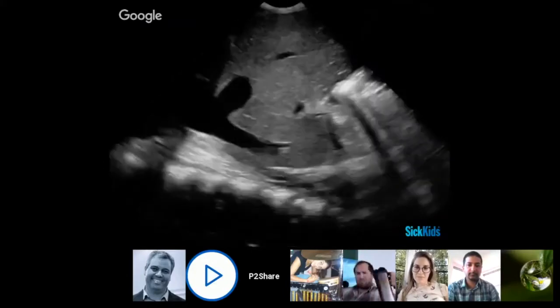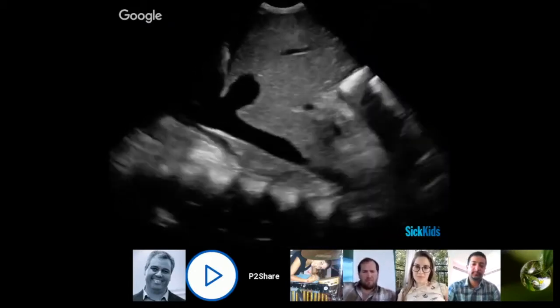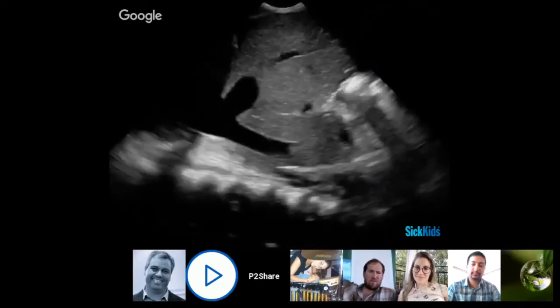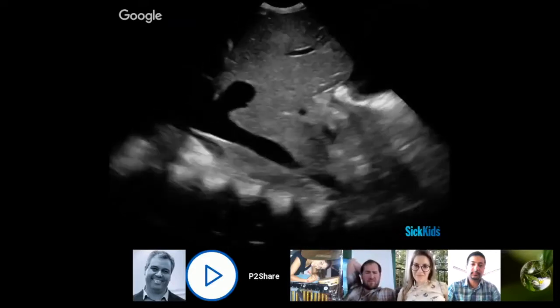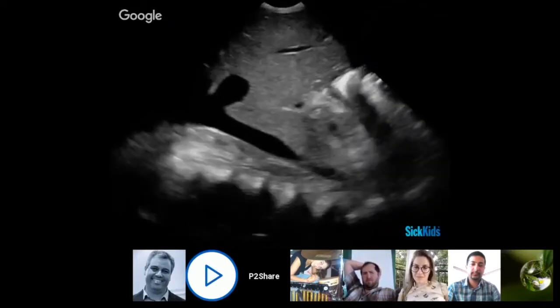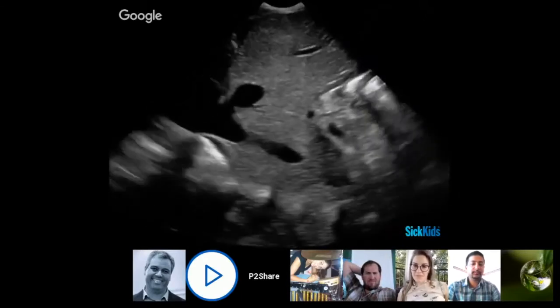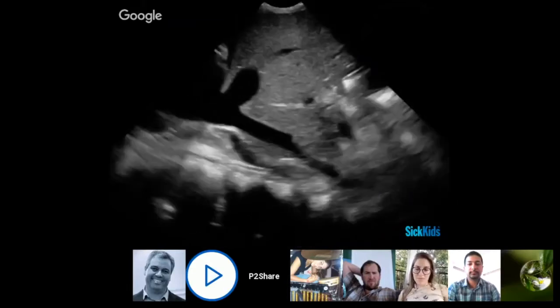Compare that to now this one, and what are we kind of seeing here? Plethoric. So when you say plethoric, what tells you that? There's no variation with the respiratory side. Right. So no respiratory variation at all. Presumably this patient is breathing, and we're basically just seeing this like barrel. And then you're also just getting engorgement of those secondary hepatic veins, right? So much thicker than you're sort of typically seeing. Very happy IVC, but not a very happy patient, presumably.